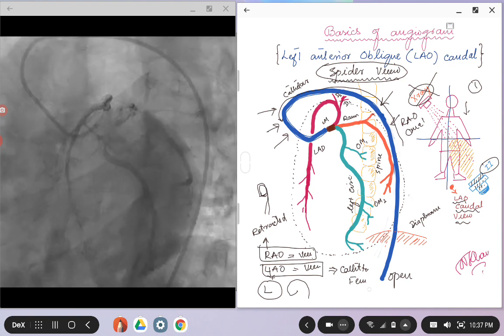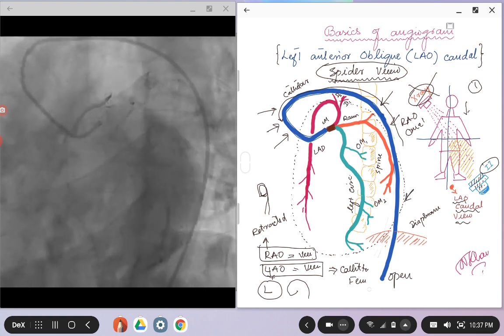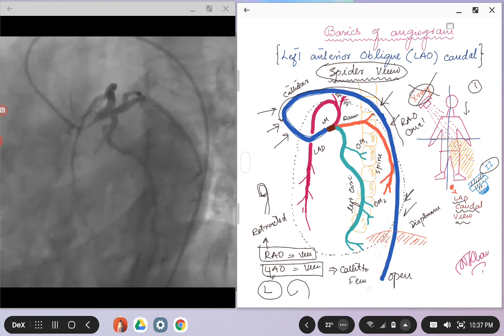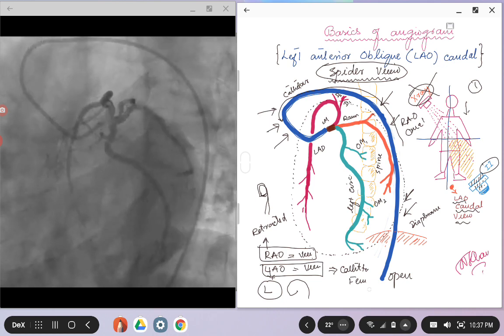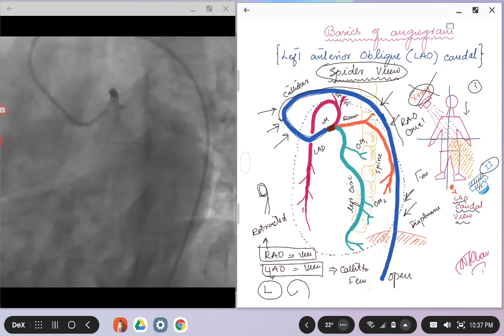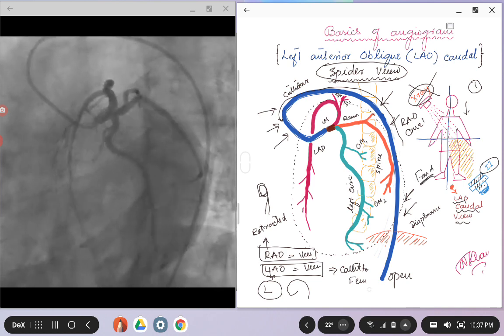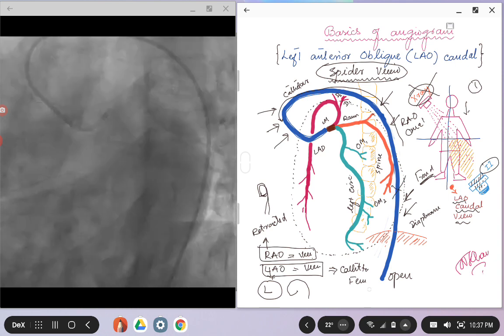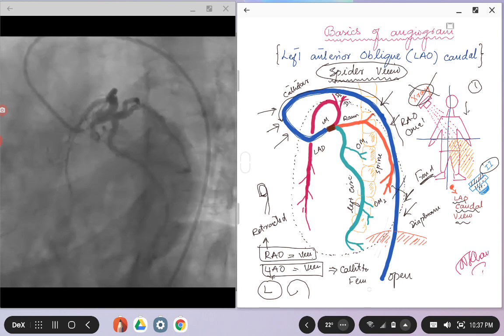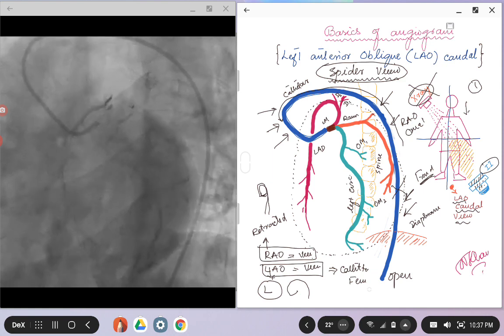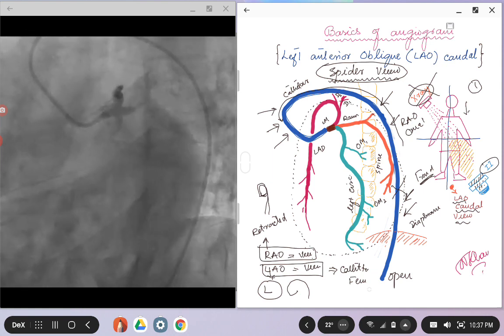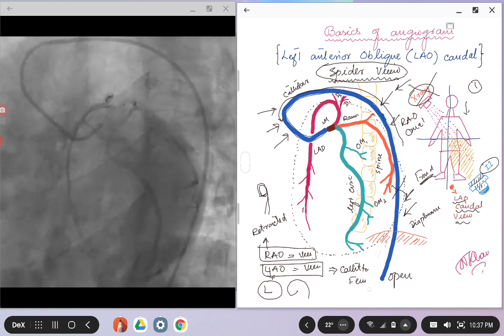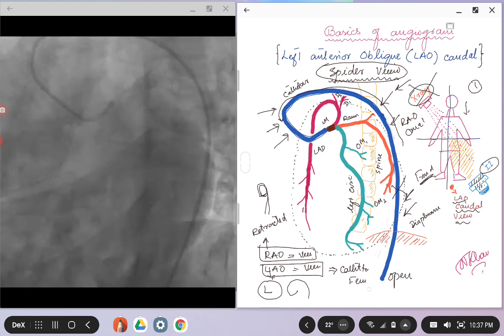So you see the catheter coming down from below the diaphragm, so that kind of tells you it's a femoral axis. Or if you don't see this catheter, then most probably the catheter might be coming from the radial axis, either the left or the right.